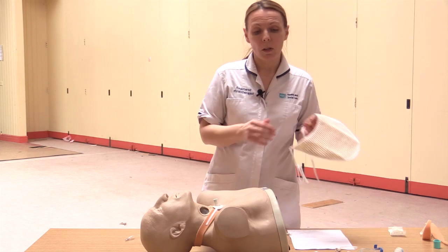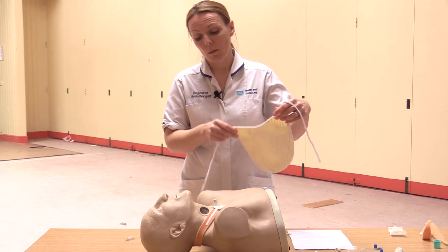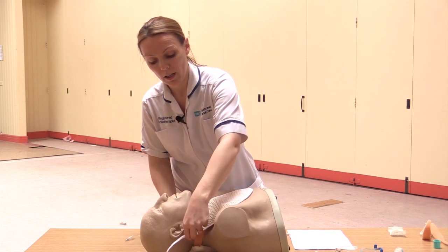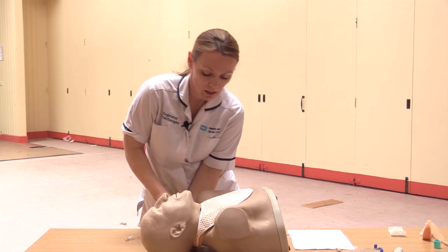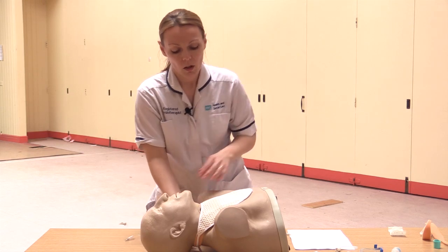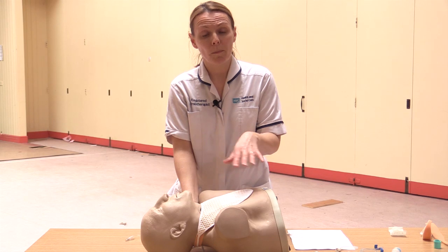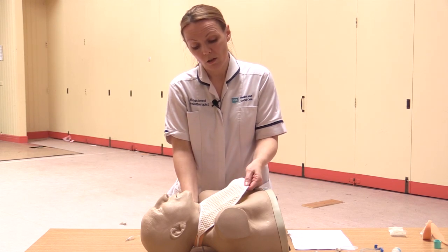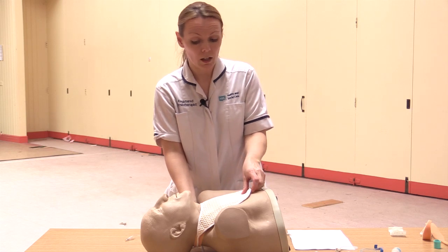Most of the patients will have heat moisture exchangers. This is known as a Buchanan bib, and most of the patients just wear that over their tracheostomy and just tie it. Okay. It just filters the air that they're breathing in through the tube. Some patients don't actually use these Buchanan bibs and will just use a scarf tied around their neck.